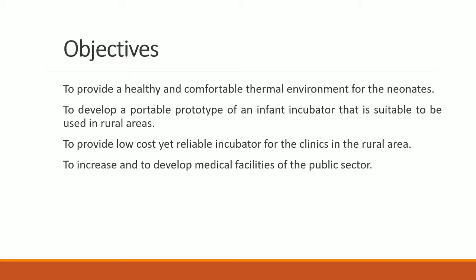Speaking about objectives, the hardware that is developed was able to provide a warm environment for the infants within a required range, and to develop a portable prototype of an infant incubator suitable to be used in the rural areas. An infant born in the rural areas will be able to receive primary care within a short period during critical conditions. And also to provide a low cost yet reliable incubator for the clinics in the rural areas, and to develop medical facilities in the public sectors. Kalim, strategy.